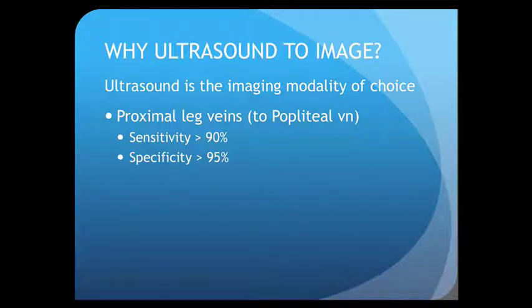And the reason for this is that it's a very good test. It's very accurate. If we look, for example, in proximal leg veins, which is what we're going to concentrate on today, it's both very sensitive and very specific.